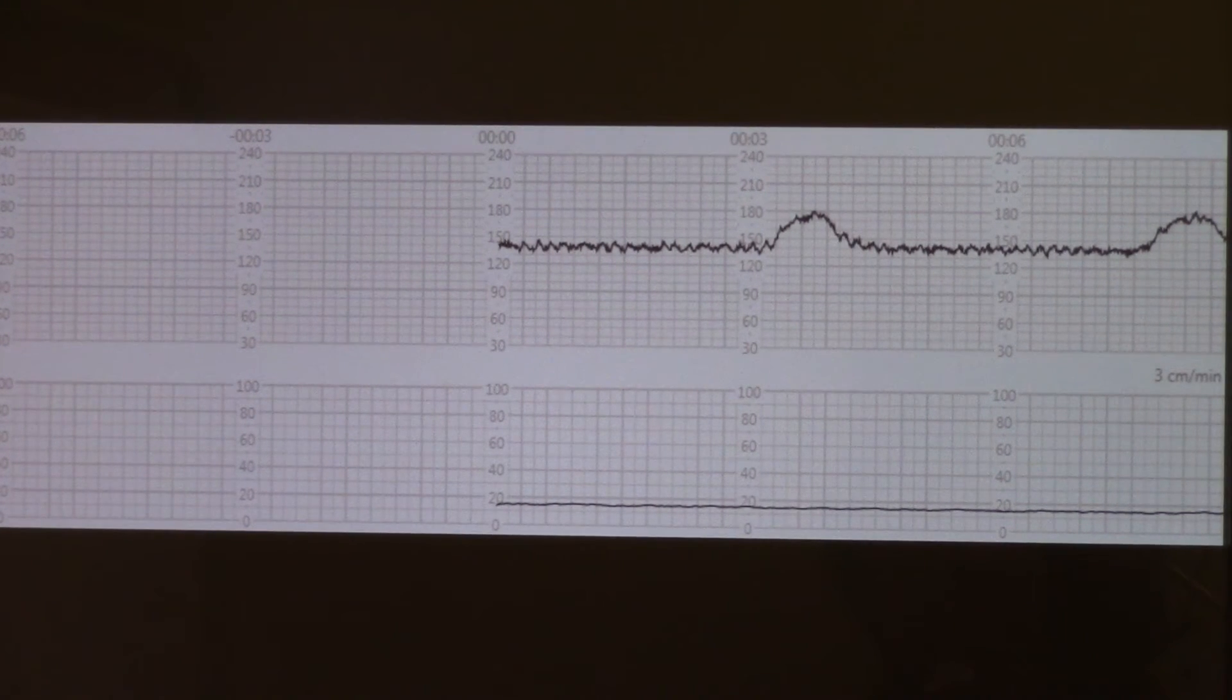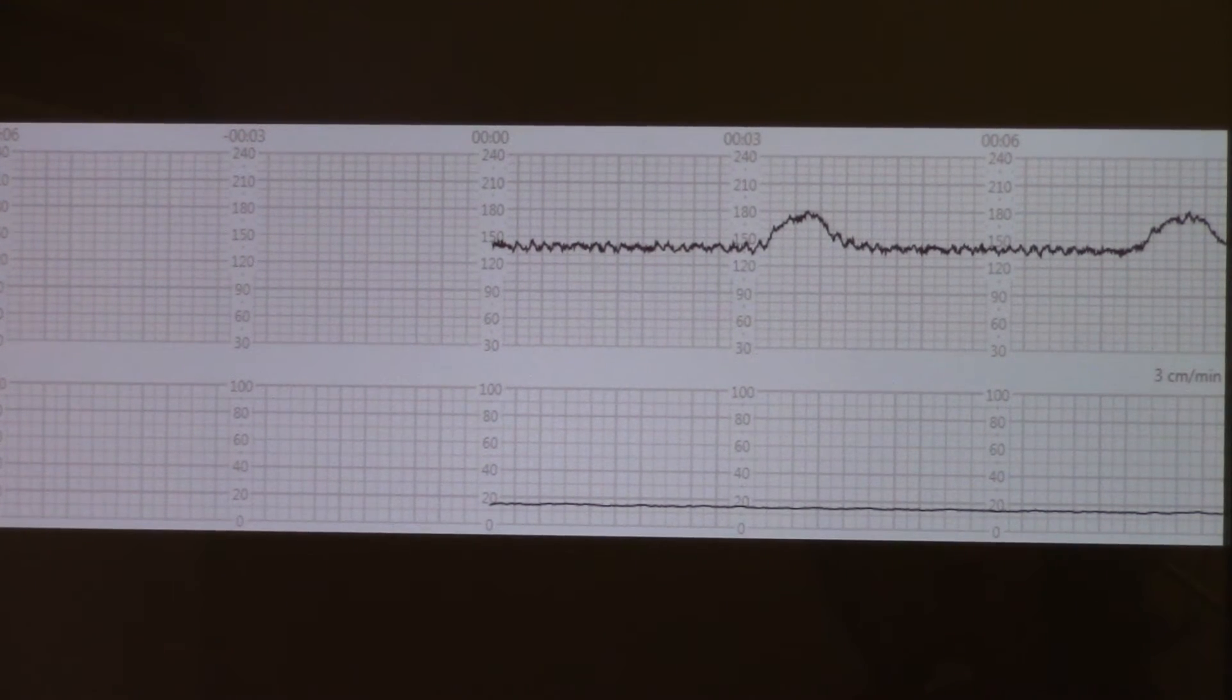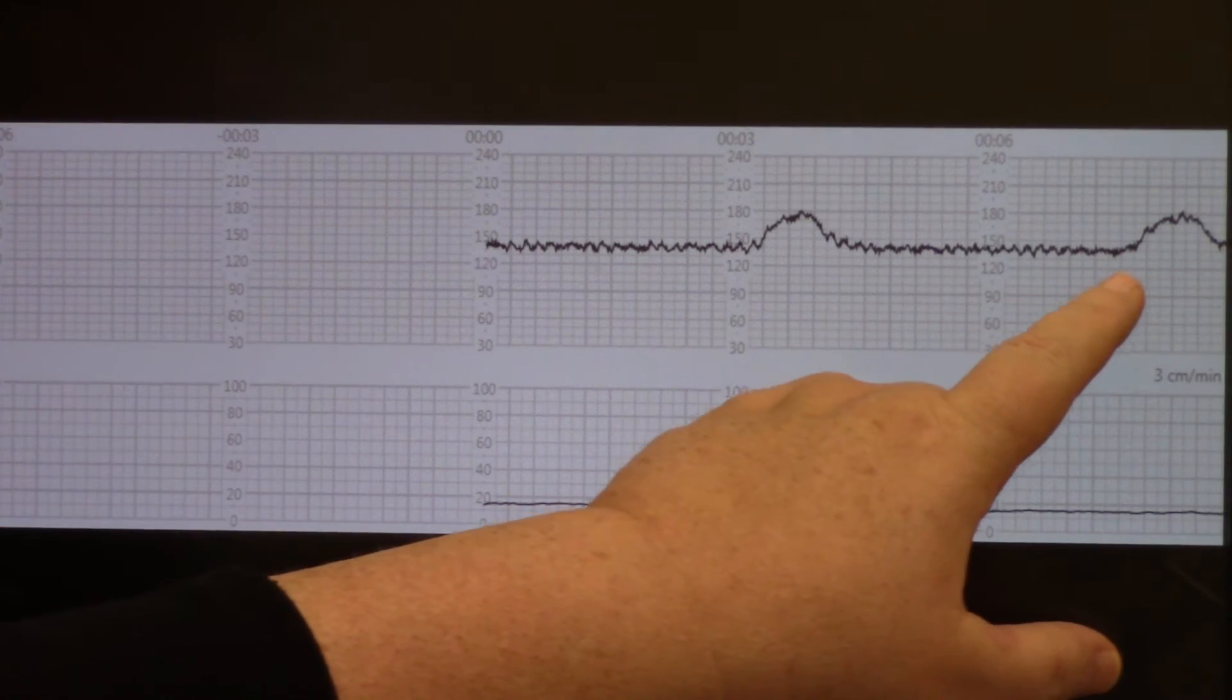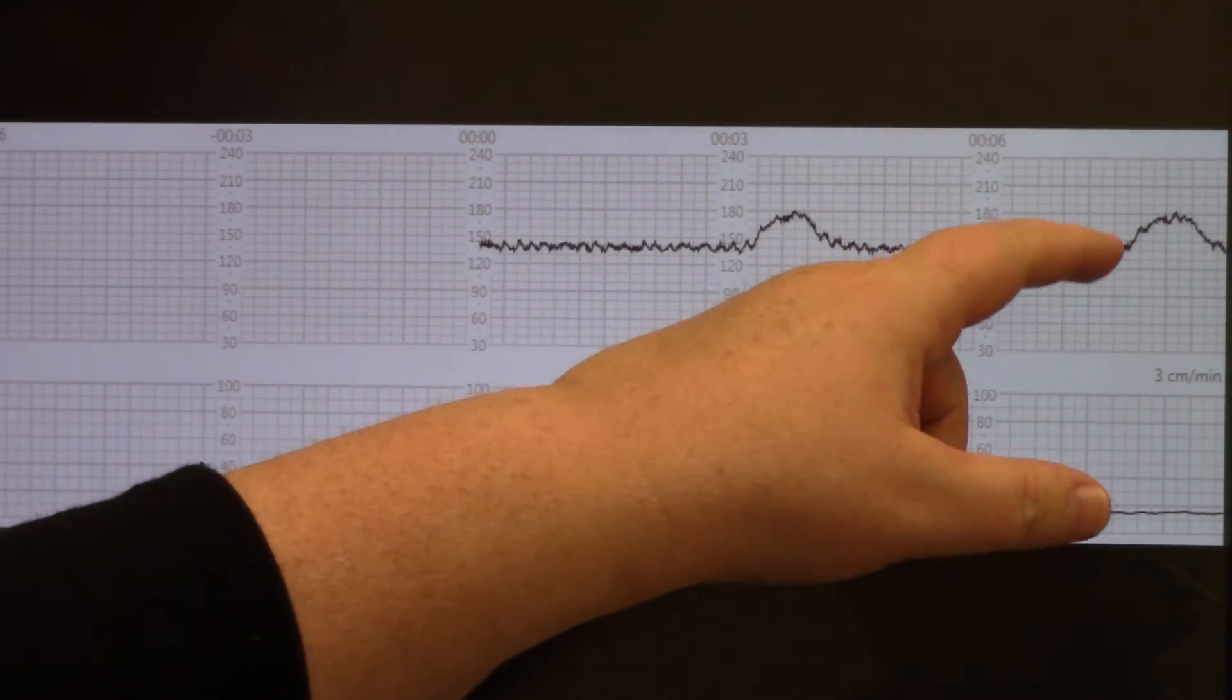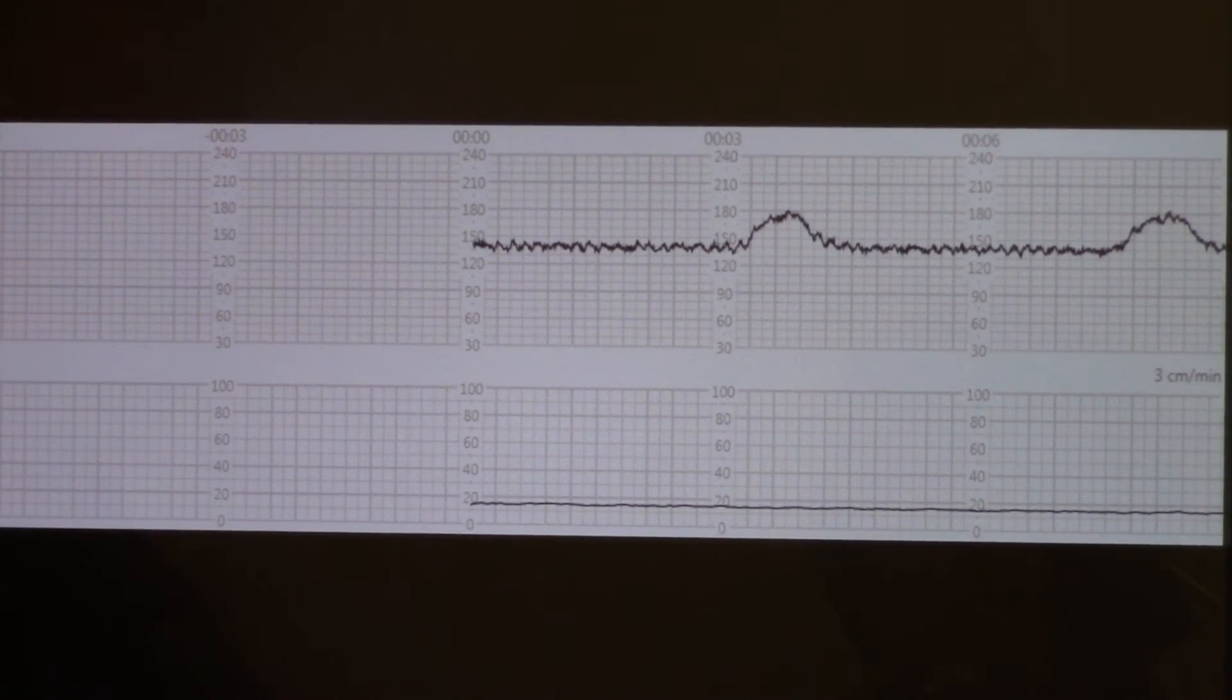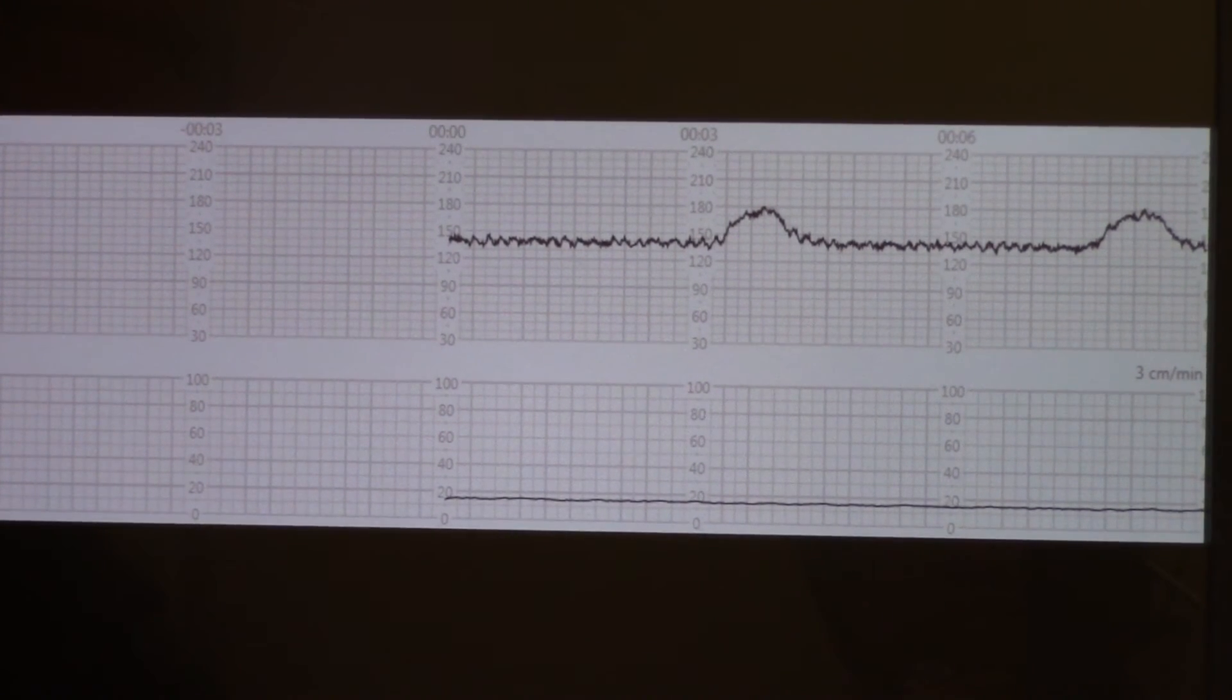This one definitely met our criteria. It definitely elevated more than 15 beats and definitely lasted more than 15 seconds. You can see that this one lasted 10, 20, 30, 40, 50, 60 seconds again. It elevated from 140s to 180s. That was an elevation of 40 beats for 60 seconds. Definitely meets our criteria for a reactive non-stress test.